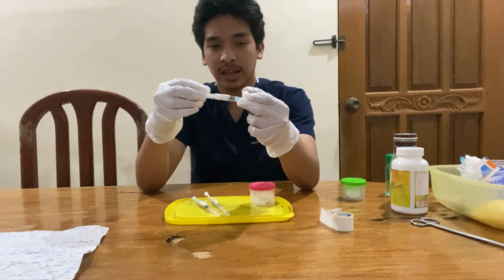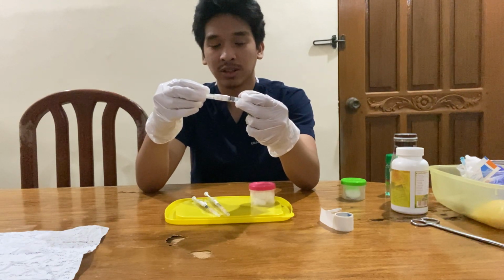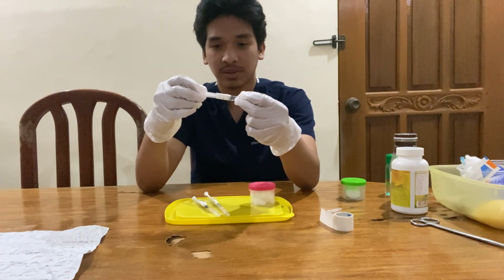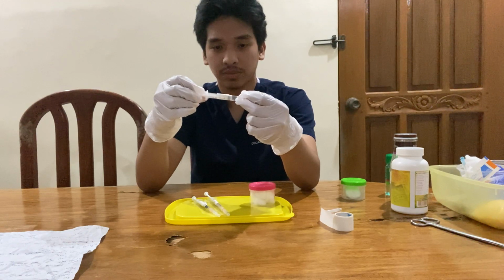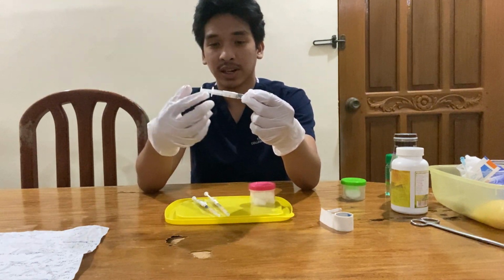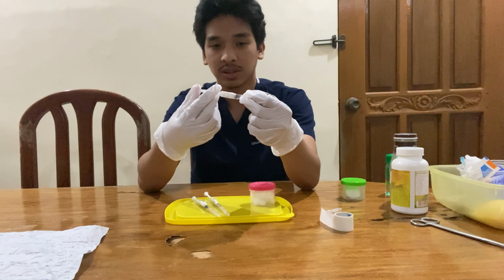Okay, and then hold it with your non-dominant hand to stabilize it, and aspirate slowly. So if there is no blood that's coming out, we're now ready to inject the medication.